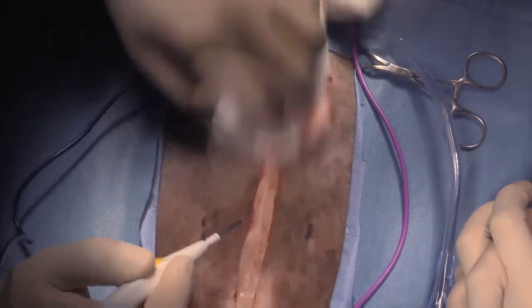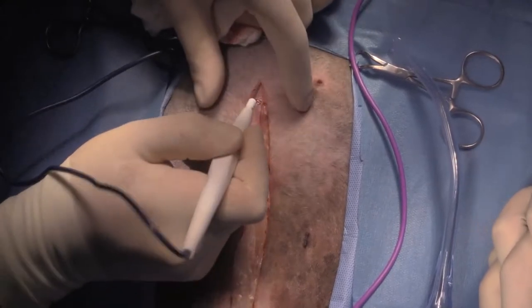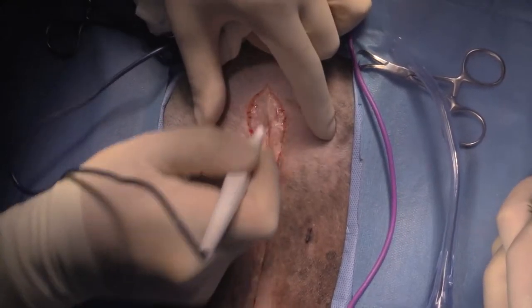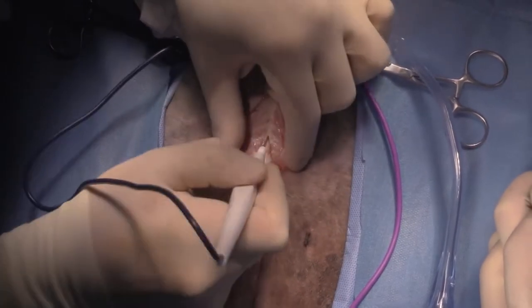Like all these surgeries, if something does start to go a bit pear-shaped or we're not terribly happy with how things are progressing in the surgery, then we might just abort and focus on managing the patient. So just be aware of that happening.